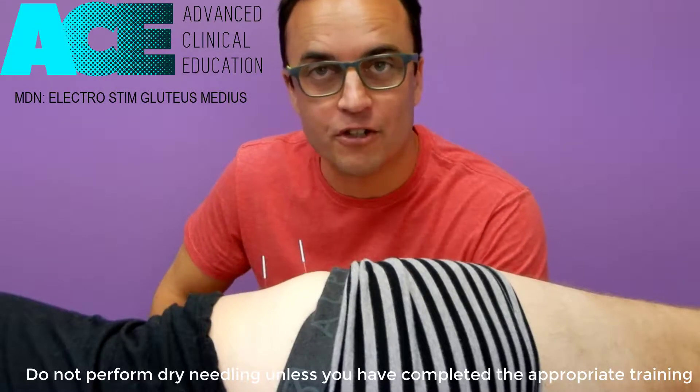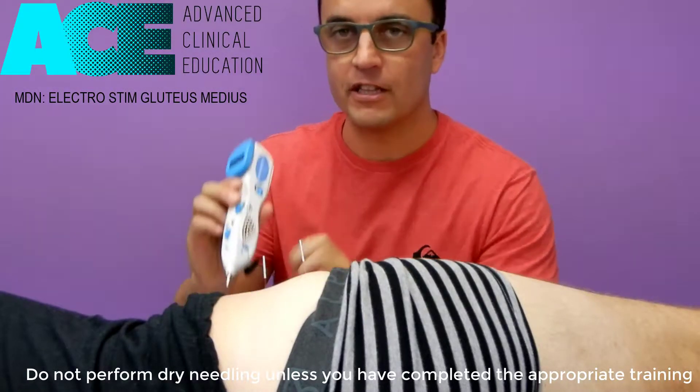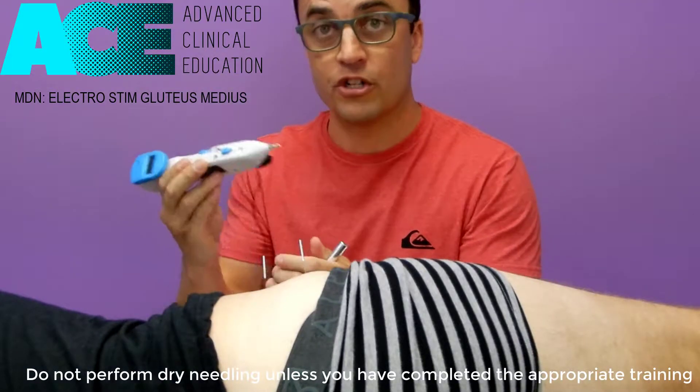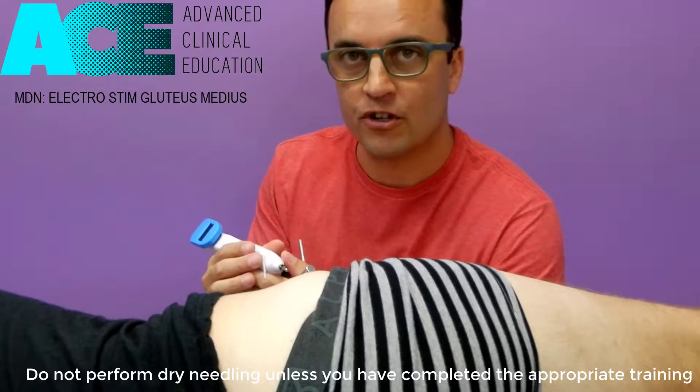We're now going to combine some dry needling with electro stim. For this technique I'm going to be using this little tool here, the Pointer XL2. This is a tool that I use quite a lot for electro stim with dry needling.